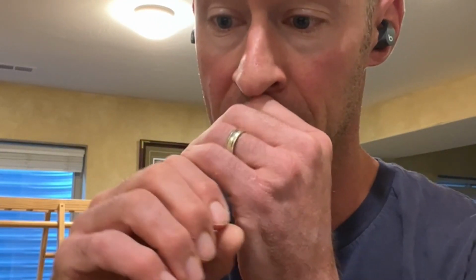The concept of compliance is important. I've said that a few times. You can think of lung compliance as a balloon, right? When you start to blow up a balloon, it's really hard. There's a lot of resistance to flow. Then when you get it to blow up, it becomes much easier. And as it's too full, the compliance again goes down. So that's your compliance curve. A balloon that's hugged from the outside will have worse compliance, because it's harder to inflate. You need to give more pressure to inflate. I don't know that you need to think of any calculations. That's just what compliance is. You can imagine how a pneumothorax would decrease your compliance, because there's this fixed lesion that the lung can't expand against. It's like something hugging one part of the balloon.